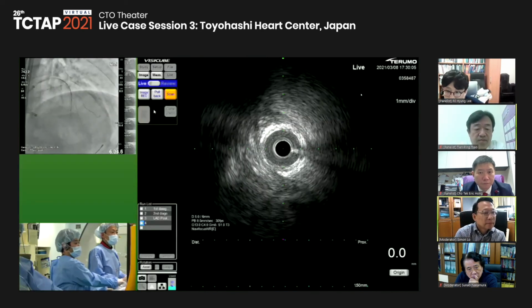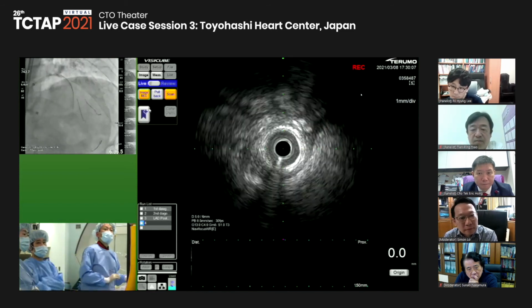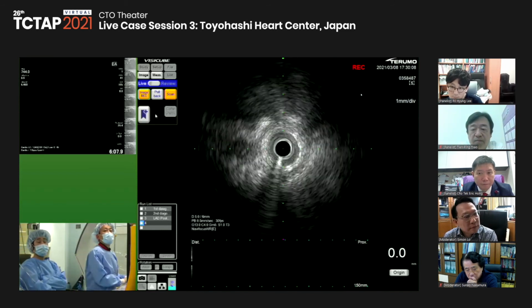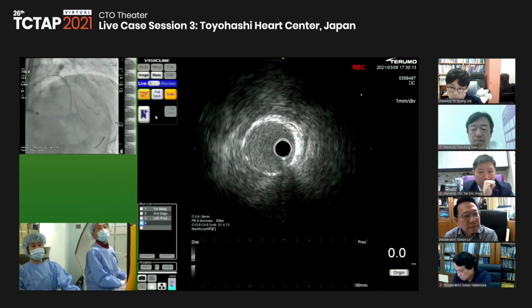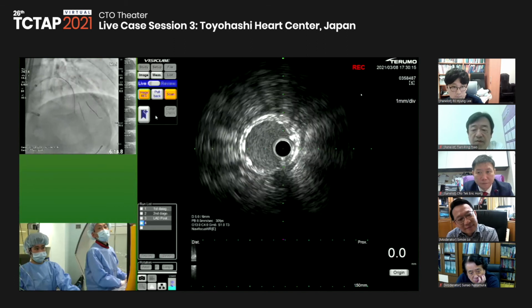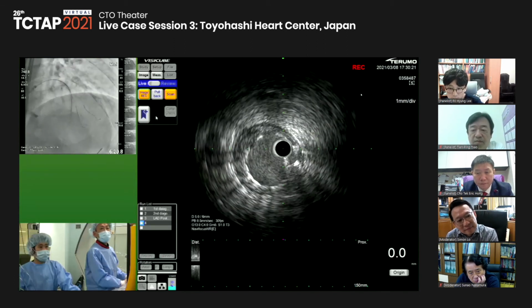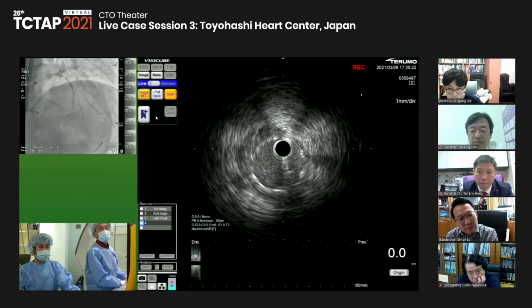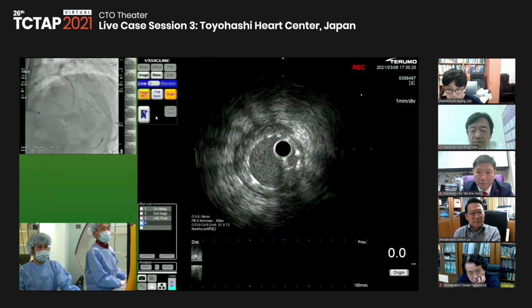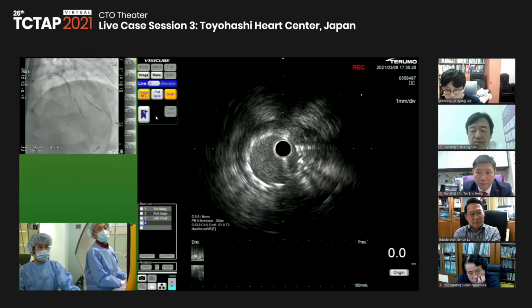Okay, stent edge is okay, maybe no dissection. Okay, plaque is beginning. So the second diagonal, it's okay.